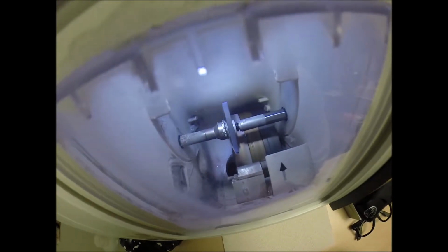Cutting wet means that water sprays onto the lens for the duration of the cutting cycle. These polycarbonate lenses cut dry, meaning that water is not spraying onto the lens. Now, having said that, it will spray onto the lens for the last 20 seconds just to wash away any optical debris you may see beginning to form on the edge of the lenses.